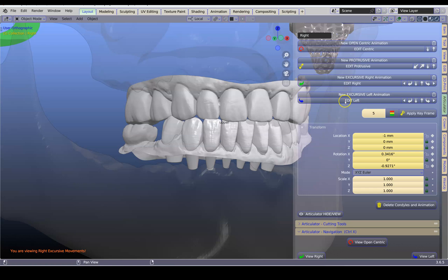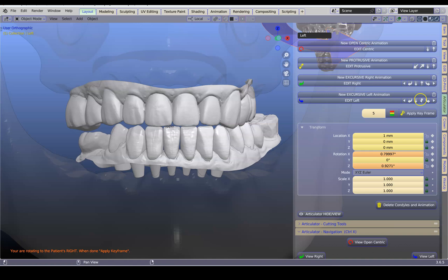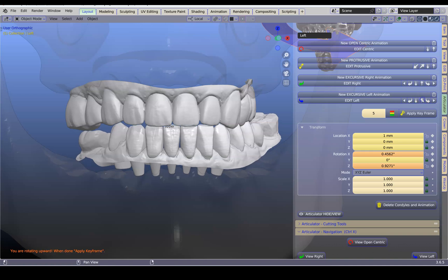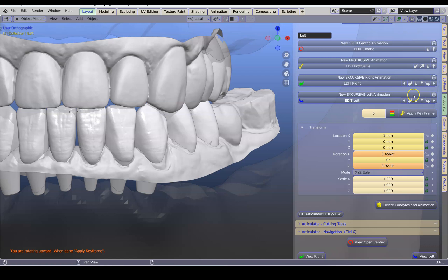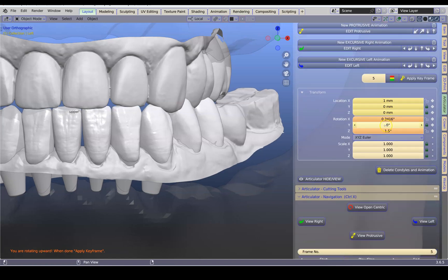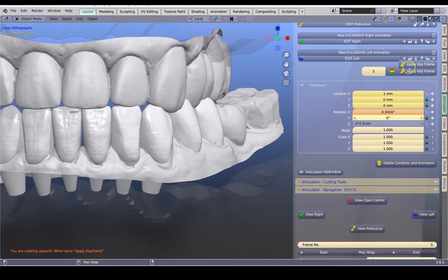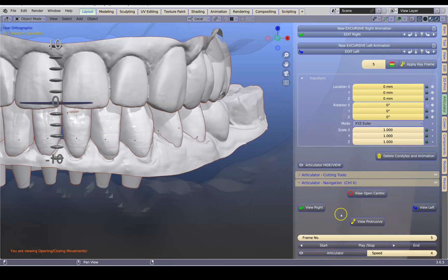Go and edit the other side. We're going to put the jaw back a little bit and close it up a little bit. Apply the keyframe. Now this has completely set up this animation.